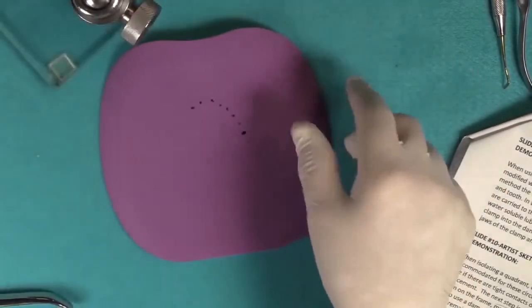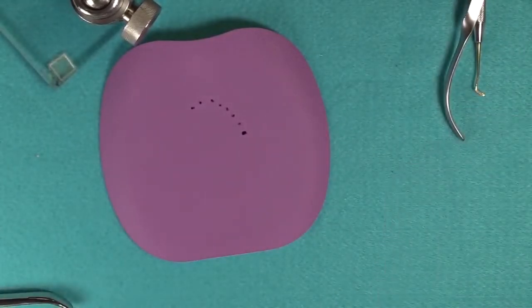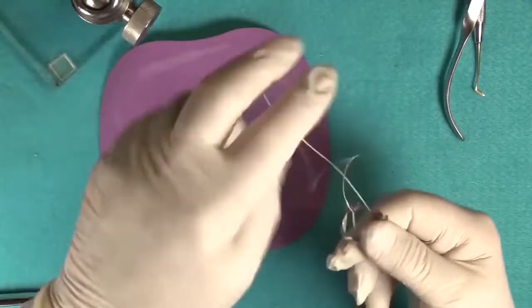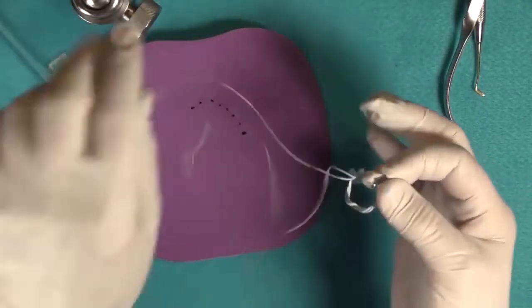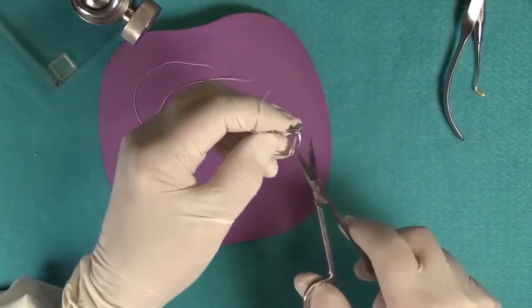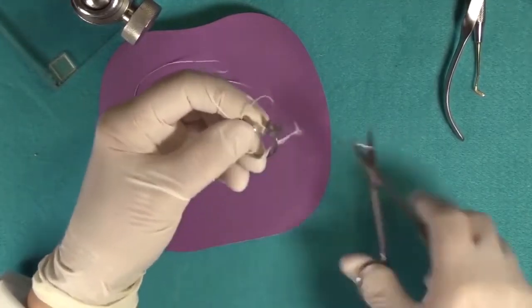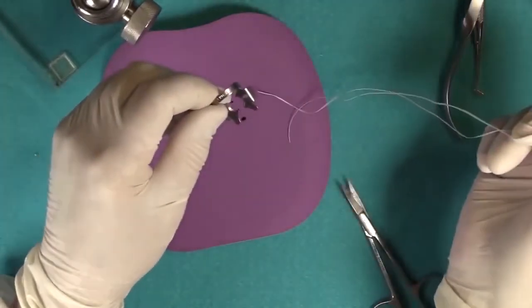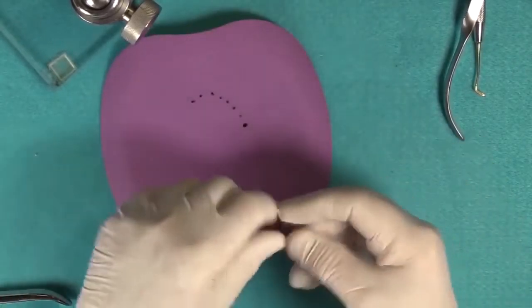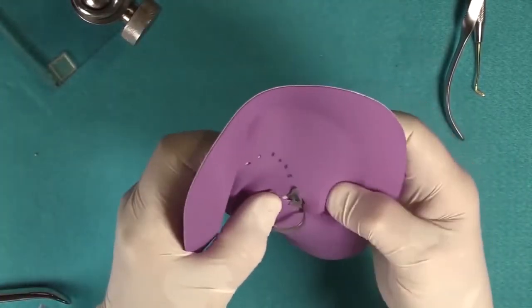So we're going to use the wing technique, and let's see, what did I do with that wing clamp? Okay. Where'd he go? Here he is. Oh, I want to show you how to clean up. When you clean this off, it's really easy. All you need to do is take the floss; it's going the wrong way. It's going to end up on the lingual. If you cut the slip knot like this, everything comes apart, just like that. Okay, so if you're using the wing clamp, you're going to put the clamp in first.